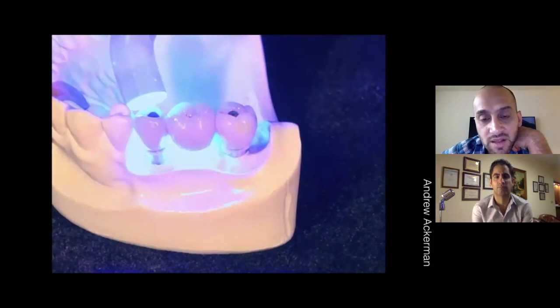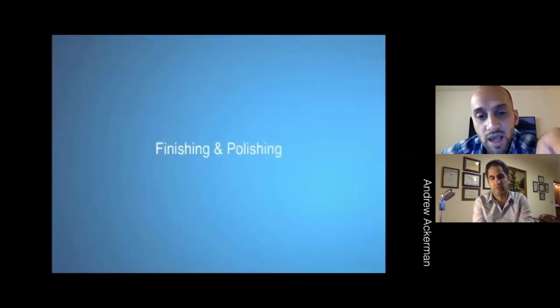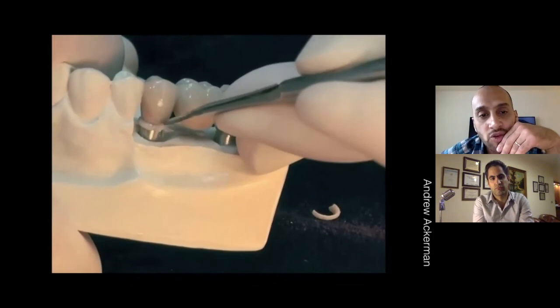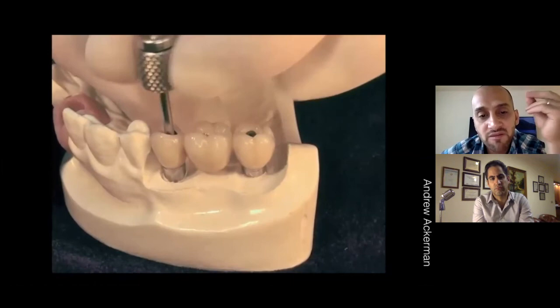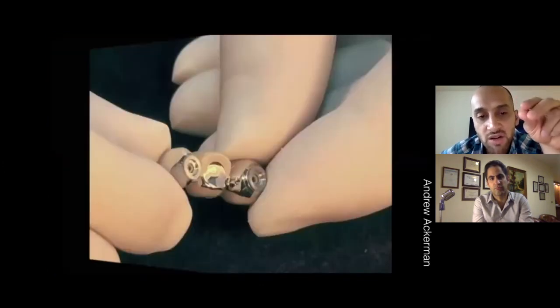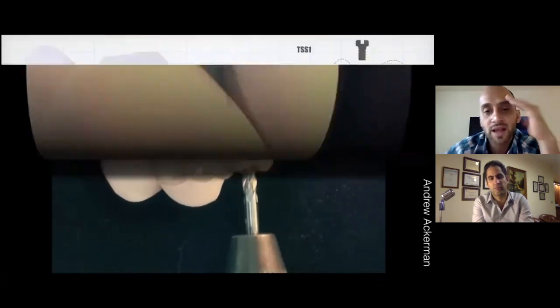Care must be done to make sure that the contact point between the three premolars is not too heavy, otherwise it will not seat properly. Once it's set, then you just break that off. This is a video that was given to me by Dr. Ackerman. You break off all that cement, and then you clean it, and what it gives you is a pristine fit of an interfacial ring that has not been subjected to laboratory degradation, oxidation of the metal, and it just looks clean. You just go in there, remove all the components that are left in there, you clean it, and then you secure it.